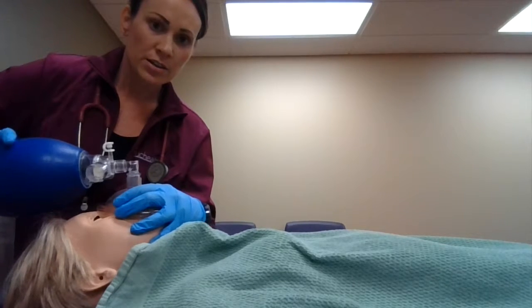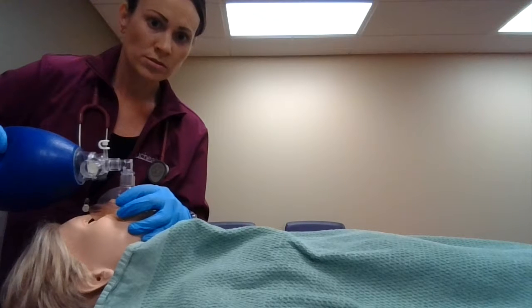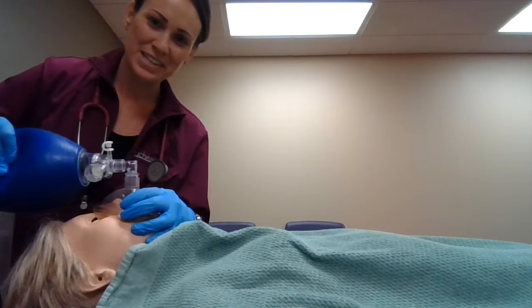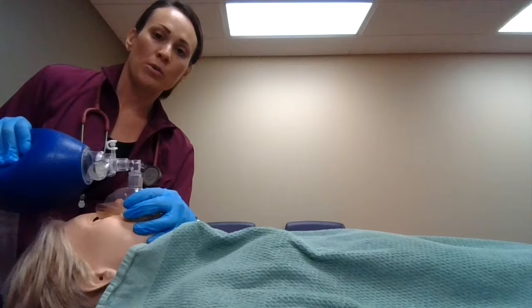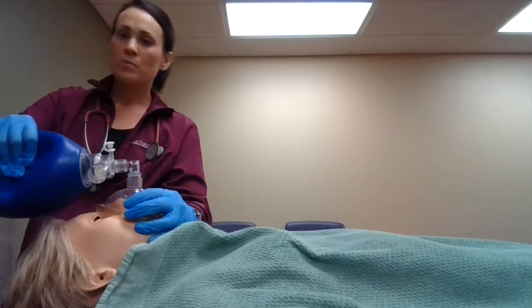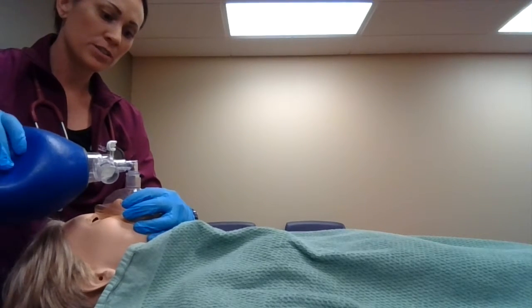I do need a tight seal around. And I'm going to administer 12 to 20 breaths per minute. I'll wait for further instruction to see if she's going to the operating room, if we're going to intubate the patient. But the best position I could be in is at the head of the bed here, administering breaths to Mrs. Smith.